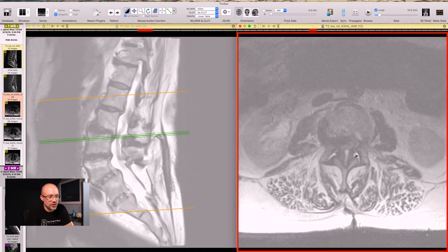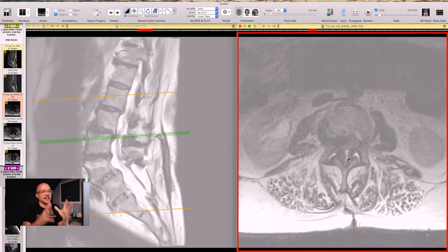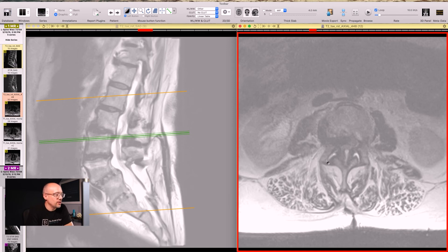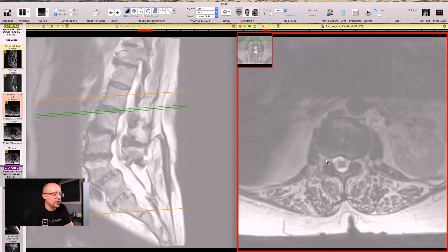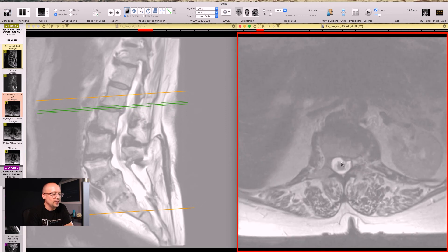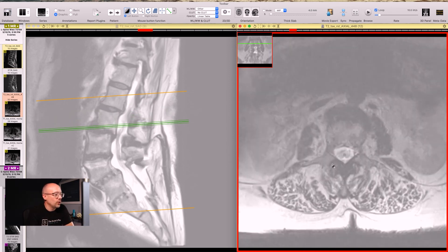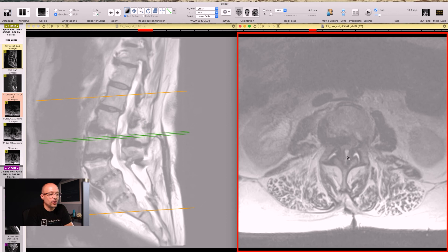Additionally, we see fluid in the facets, those little white streaks. That's fluid in the facet joints. And we see that big black V right here. There's a ligamentum flavum. That's a ligament that sits inside of the spinal canal. That's very thick and hypertrophic. It's causing a lot of challenges for this individual. So really, really stenotic as we get up towards L1, L2. Look at that. Looking great. We see a little bit of a disc bulge right there, but look how wide open that spinal canal is compared to what we had down below and how compressed that was.